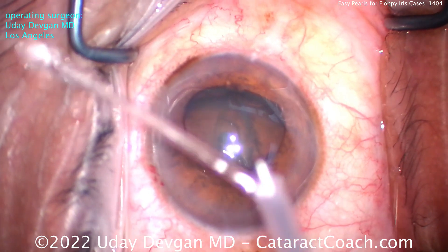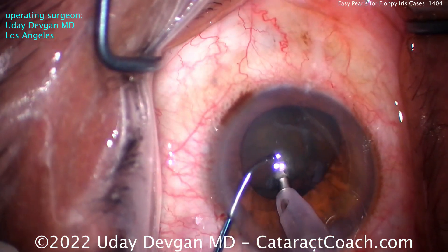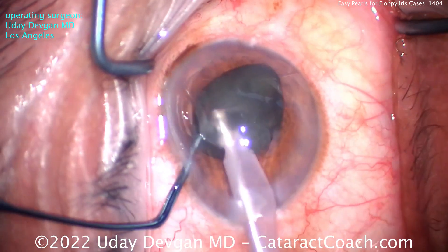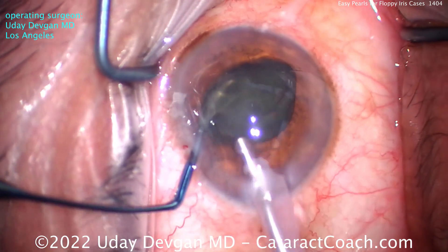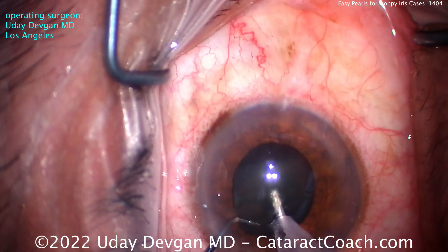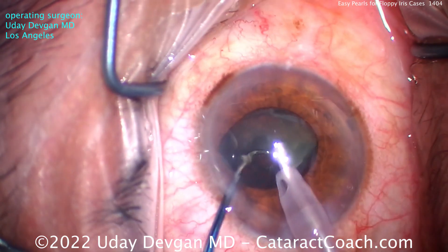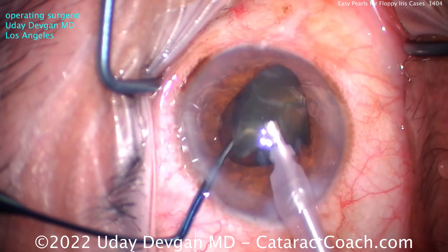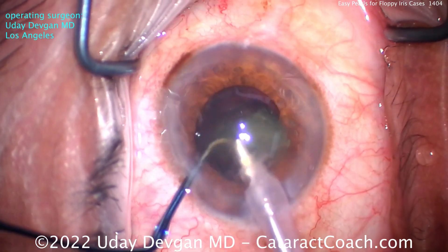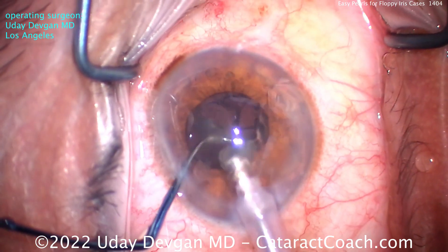The first thing we need to do with the phaco probe is split this nucleus — make it into two halves pretty quickly. The phaco probe goes in, chopper goes around the equator, and there you go. The first half can now be removed. It does feel cramped and crowded — this patient's getting a 25-diopter lens, a little bit of a smaller and shallower anterior chamber, plus the Flomax and the floppy iris. But we can just work centrally and bring the piece towards us. I don't sub-chop the nucleus into too many smaller pieces — two halves is enough. Using that phaco probe again, emulsifying that down, and just like that, in a pretty efficient manner, that nucleus is gone.